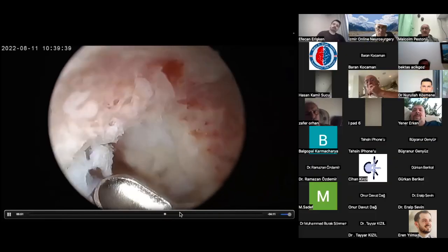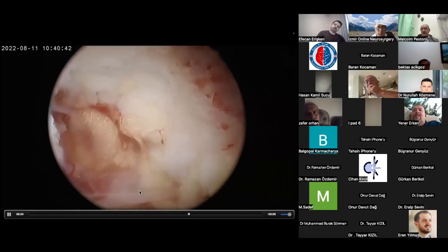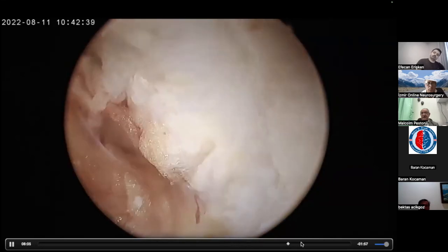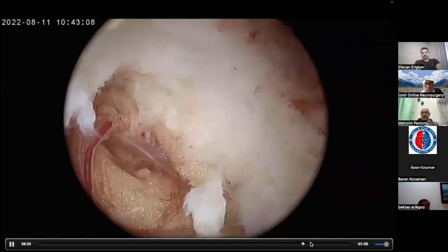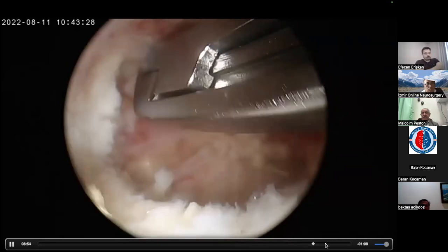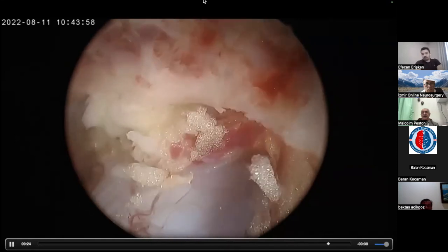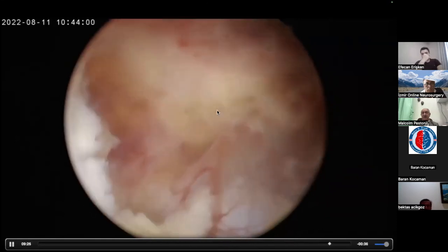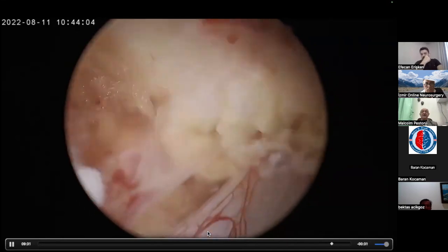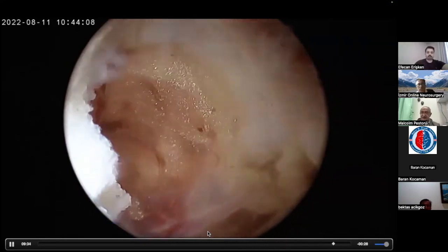To the point that you have completely freed the exiting nerve root. So that is the advantage of doing an ipsilateral shift and undercutting surgery. Keeping the IAP, SAP by and large intact. You can see the laminar surface. You can see your own side. You can see that you are over the dura on your own side. So this is an ipsilateral undercutting surgery.